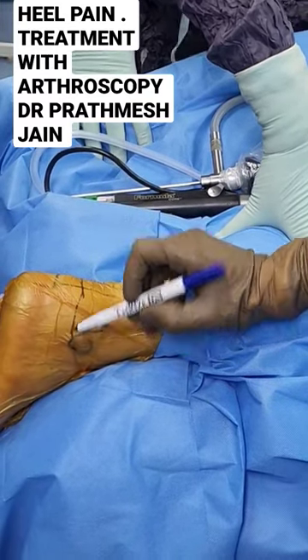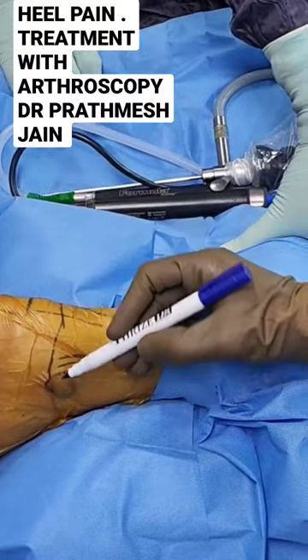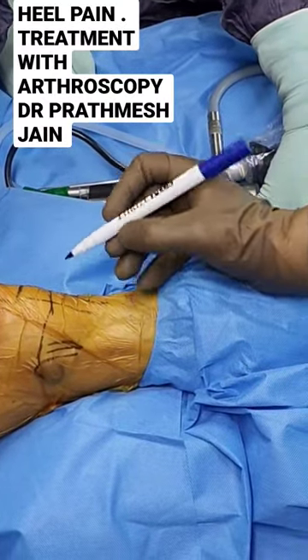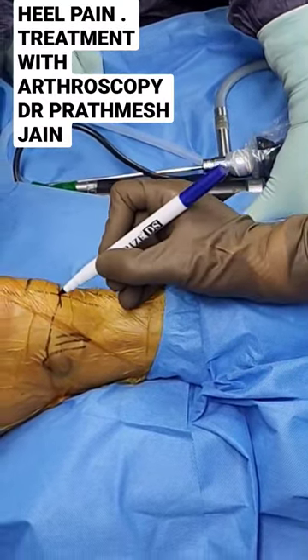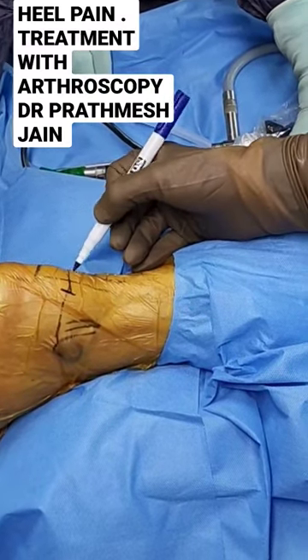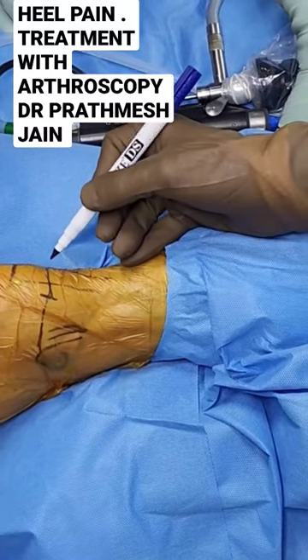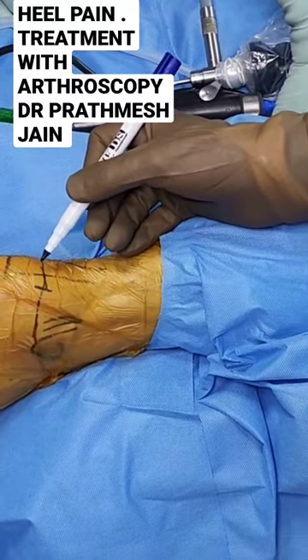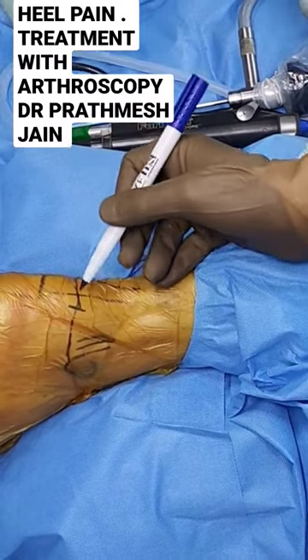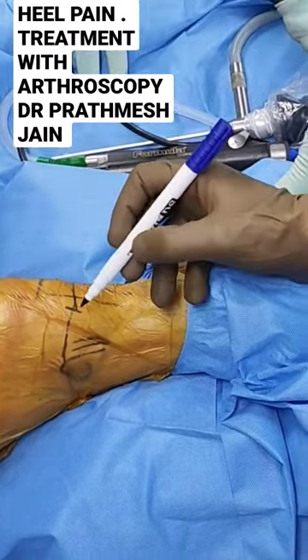The tip of the lateral malleolus is connected to the tip of the medial malleolus by a line, and all the portals can be placed on this line. We place one portal here and one portal here — these are called the lateral and medial peri-Achilles tendon portals, and they are very useful for evaluation of posterior pathology.